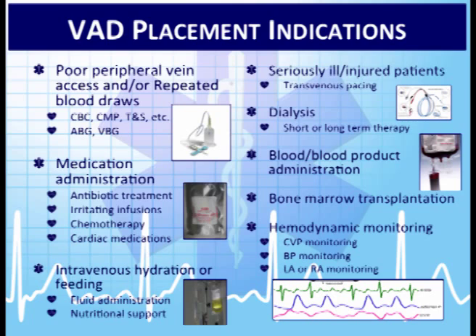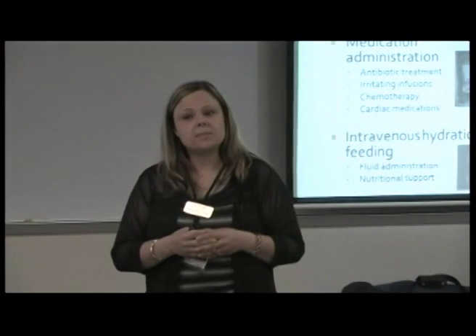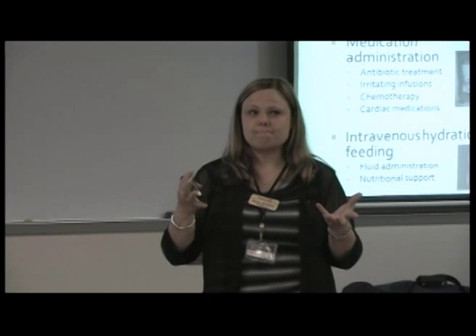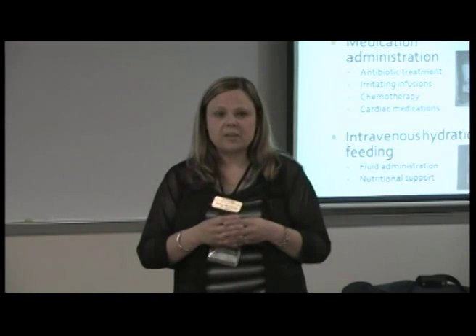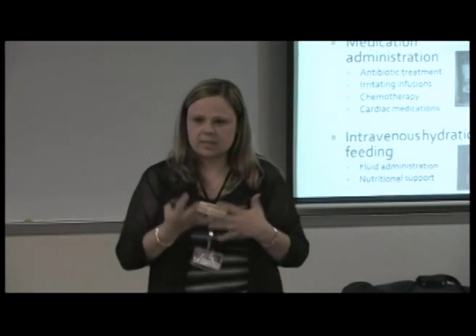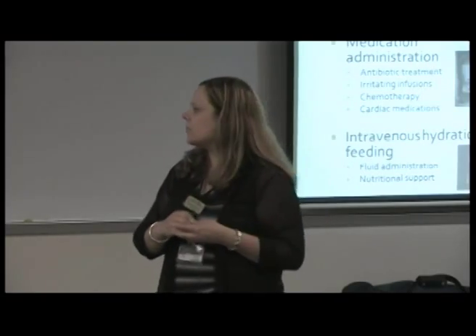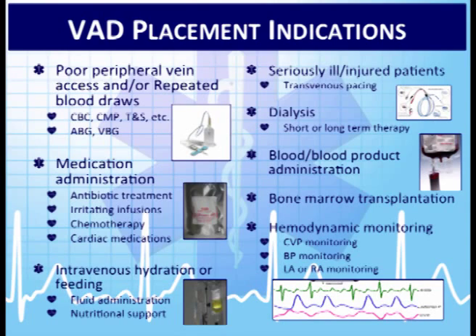Intravenous hydration or feeding: various populations have central lines. When we think about anorexia, those are some of the patients that may need the intravenous hydration or feeding. Sometimes in long-term care facilities, the patient doesn't want just hospice care. They would like to sustain life, and they may need that by having intravenous fluids or intravenous feeding. Seriously ill and injured patients: let's say you get a patient in the field and they have a heart block, okay?